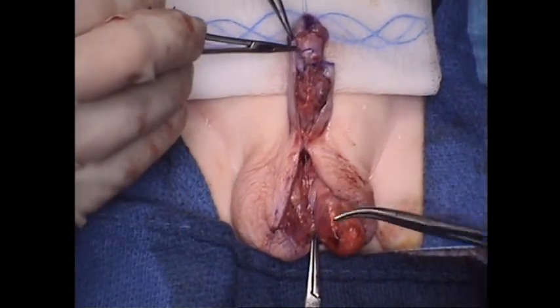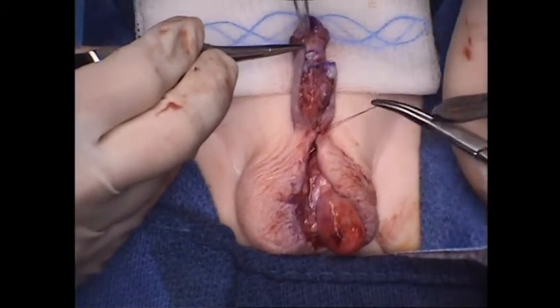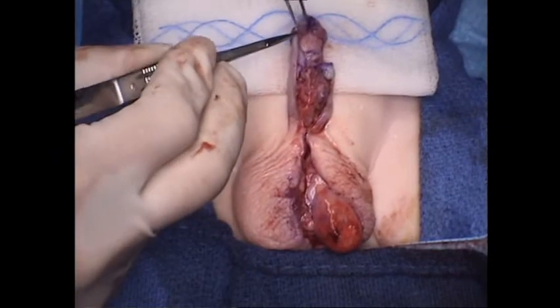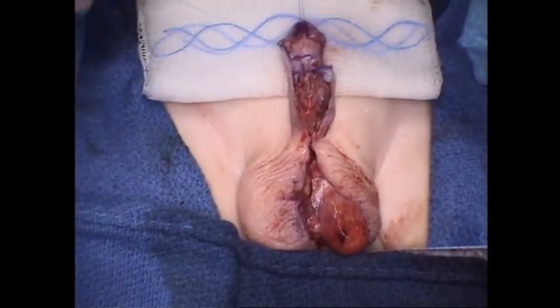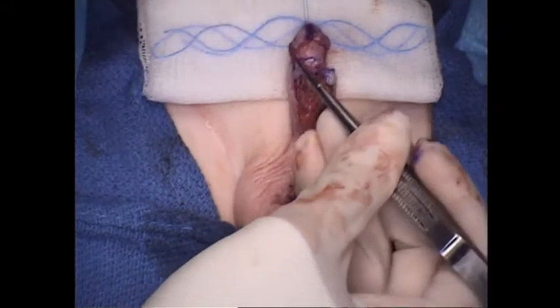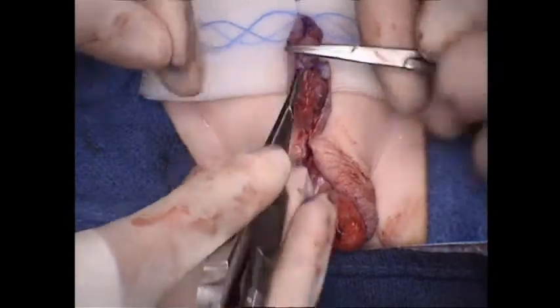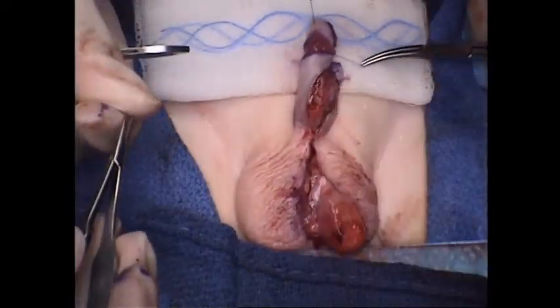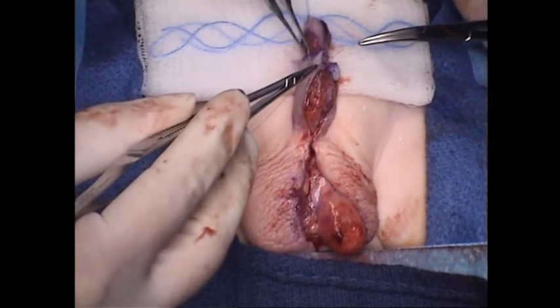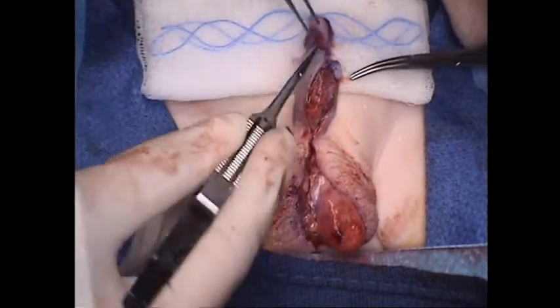All right, so we can cut that out now. Remove tension as we're sewing these back. I'll go ahead and place this one suture here epithelially because oftentimes this skin will be really thin along the mucosal collar and it's easy to tear. It's difficult to make up skin along the mucosal collar, so you want a nice secure suture right here. And again, this is through the area where our junction with our graft will be, so that we don't have to worry so much about a skin bridge or a suture tract there, because in the next operation, our incision along the graft will likely carry us through that.